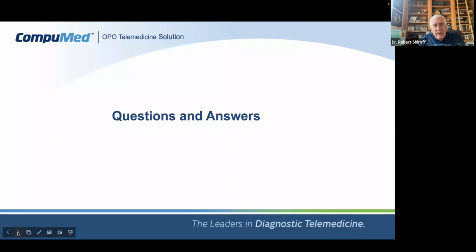In the middle of the study, the patient received the IV metoprolol, IV beta blocker, and all of a sudden the ejection fraction dropped into the 30%. And the echo technologist recognized that it happened and waited a few minutes and repeated part of the study again, and the ejection fraction is back up to normal. Beta blockers are certainly indicated and useful in multiple clinical settings, and should be customized to use.